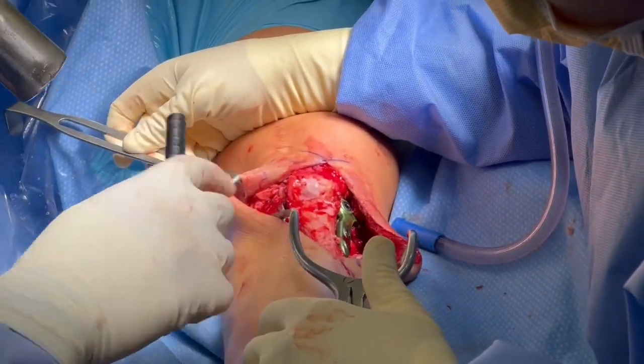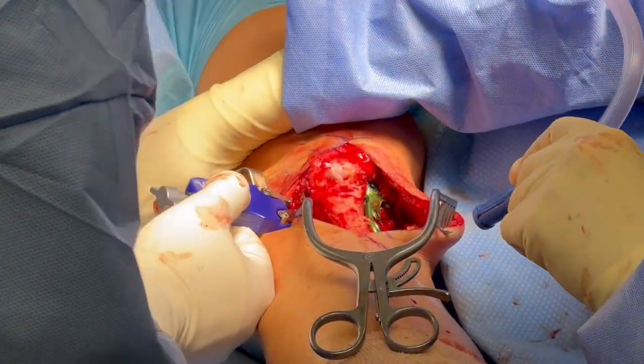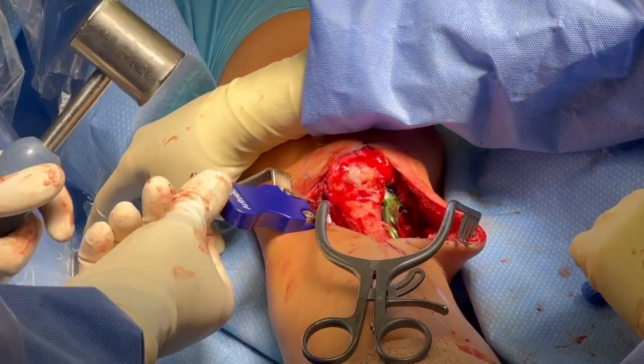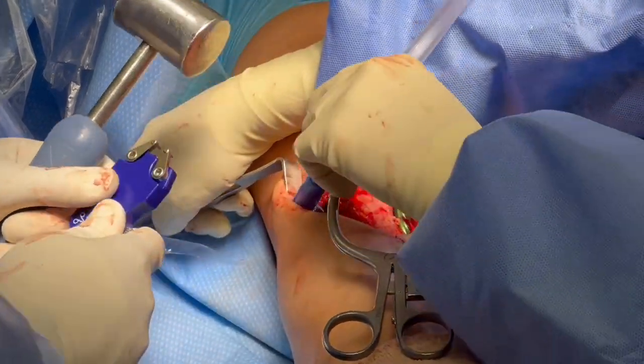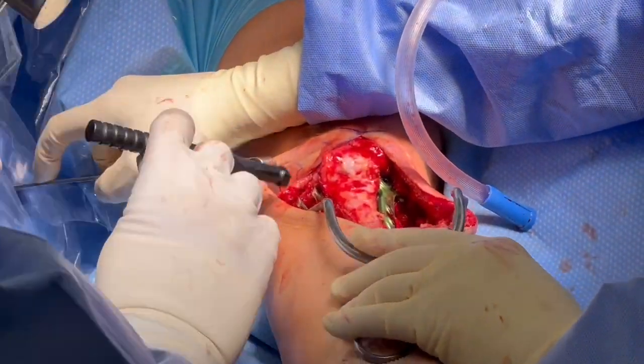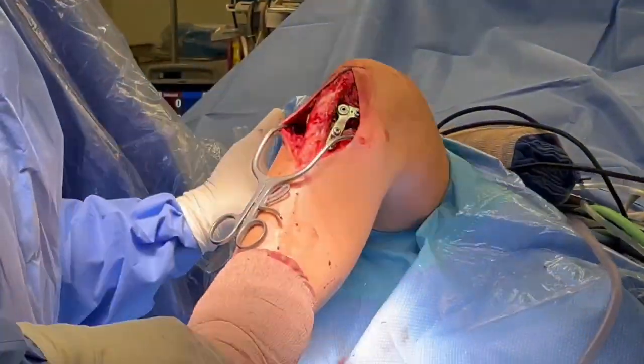We're going to compress these staples down. This is extra robust fixation. We're going to place two of them, then remove the handle and compress both of them down. These compress the osteotomy on that side to help with healing. These patients tend to do quite well with healing, especially if we're able to get the plate fixation on as well.